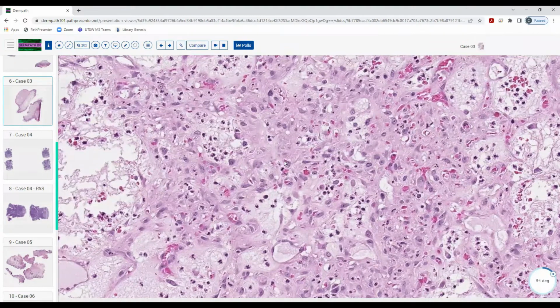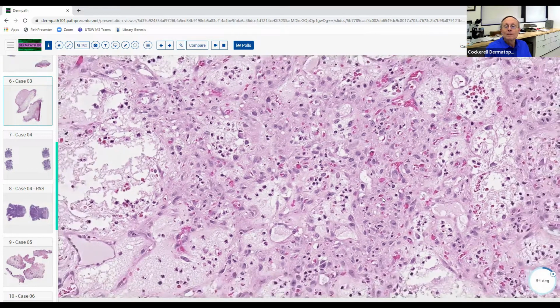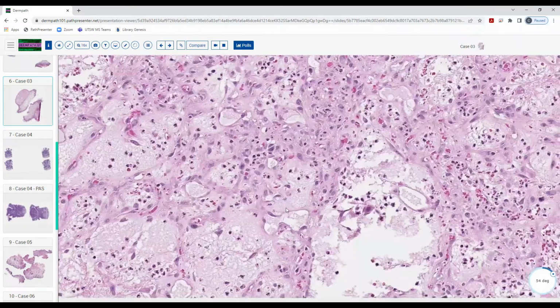And this then doesn't also really, go ahead, sorry. No, I was just going to notice that this kind of looks sort of fuzzy and pinkish and a little bit amorphous, some of these areas here too. That's kind of a clue to this diagnosis also.